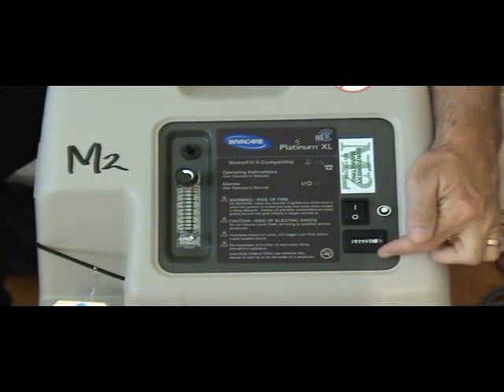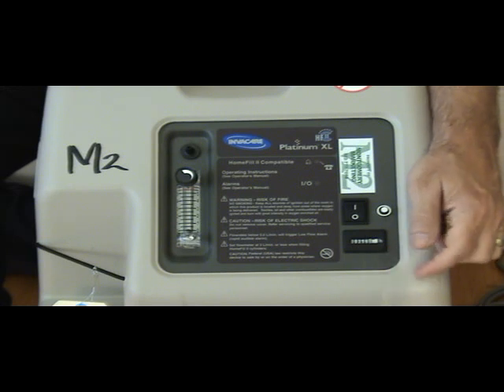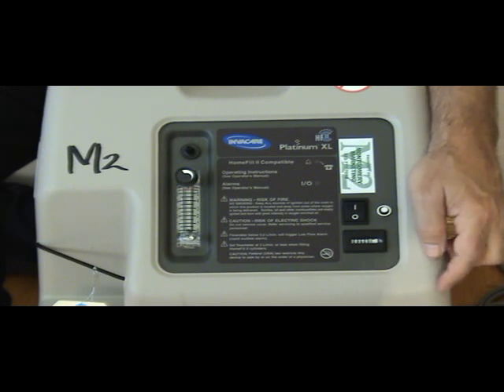This is the hour meter. This is actually something that you shouldn't be concerned with. The hour meter is something that we use when we're doing preventative maintenance or when there are certain maintenance issues that need to come up. We monitor the hours and we take care of them on an hourly basis, similar to what you would do in servicing your car.